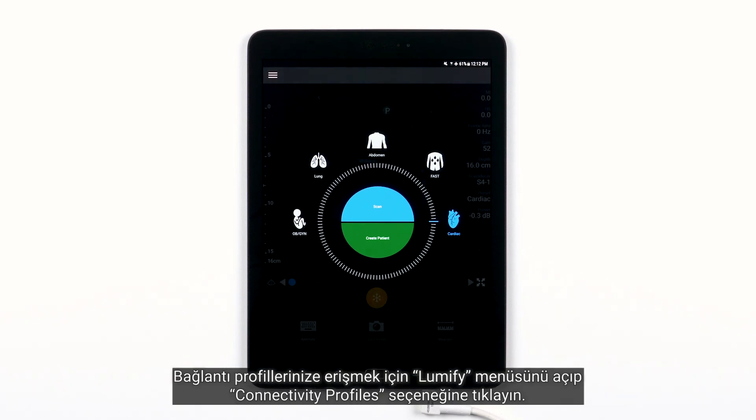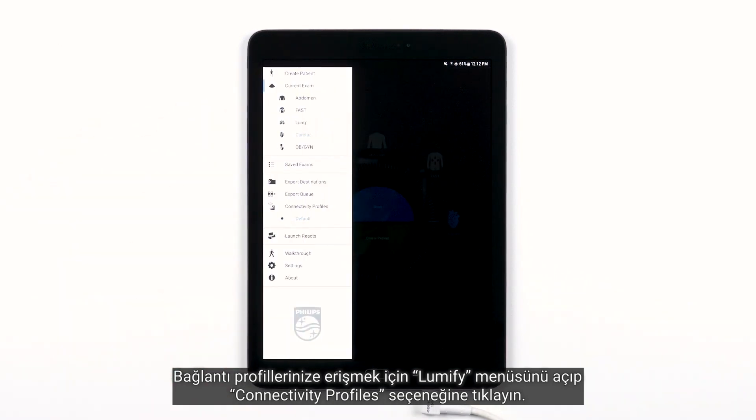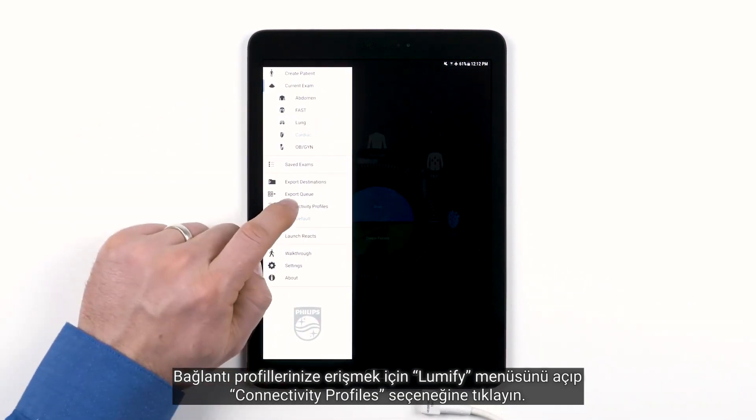To access your connectivity profiles, open your Lumify menu and tap Connectivity Profiles.